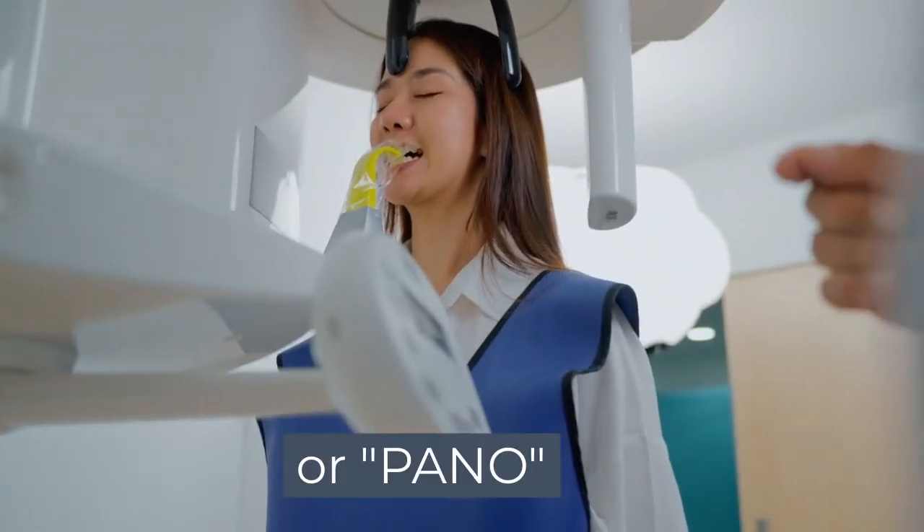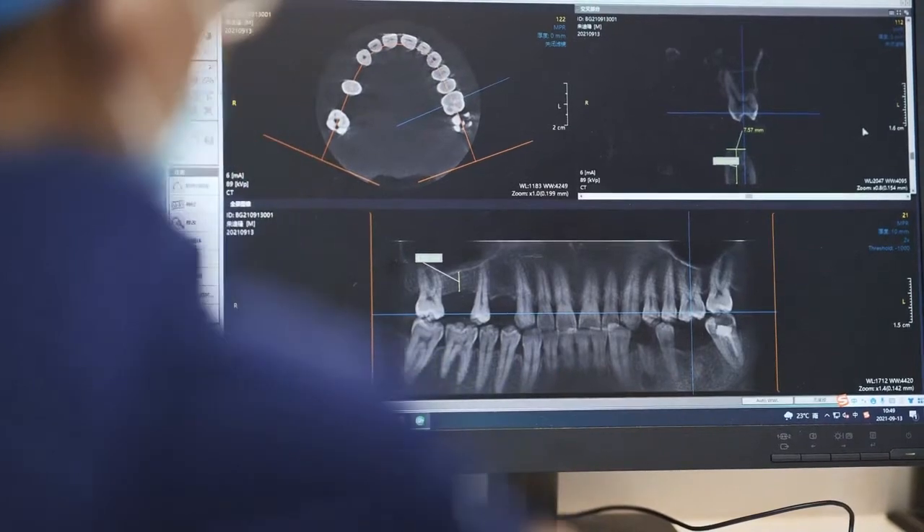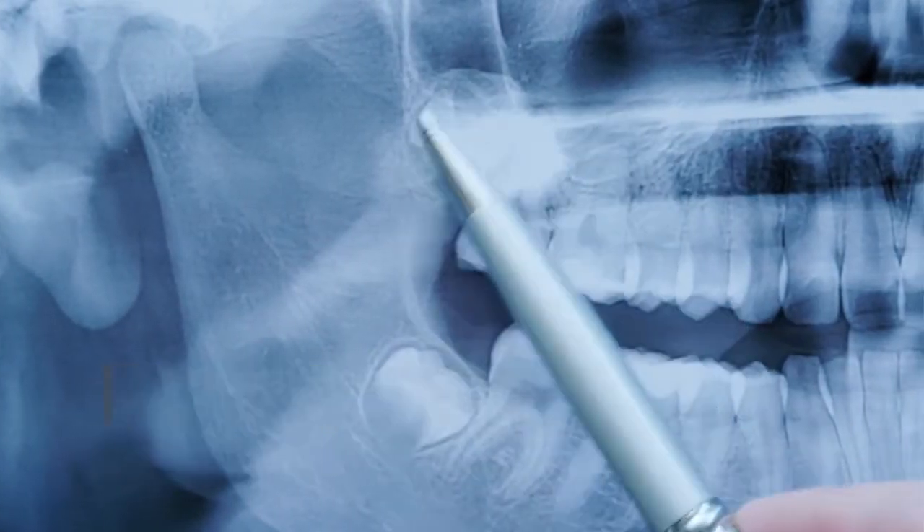A panoramic x-ray, or PANO, is a full-mouth image that captures your entire mouth, including your teeth, jaw, TMJ, and areas around your wisdom teeth.